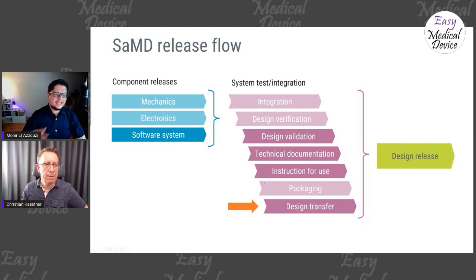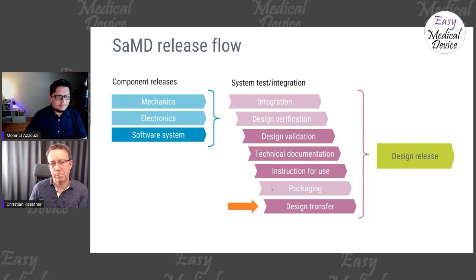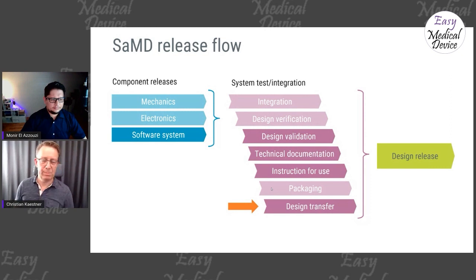I think it's interesting because with physical products, we are transferring that to a plant where they have to put it on a machine and create a physical product. But here, normally, when we finalize the development, the product is already done, it's available, and it can be placed on the market. But still, if you verify your software, how do you know it works exactly the same in your production environment or your deployment server? There's still a requirement you at least need to consider.